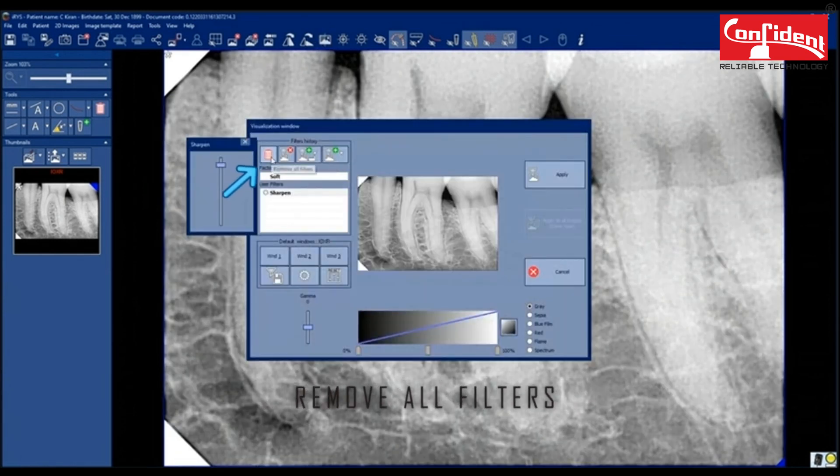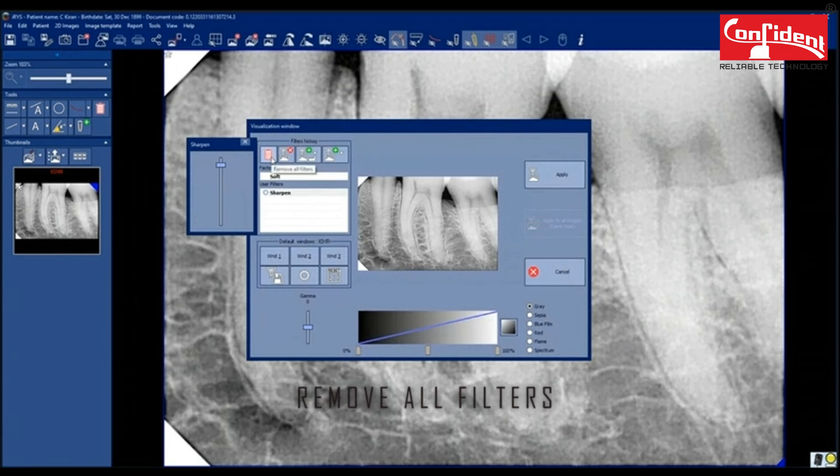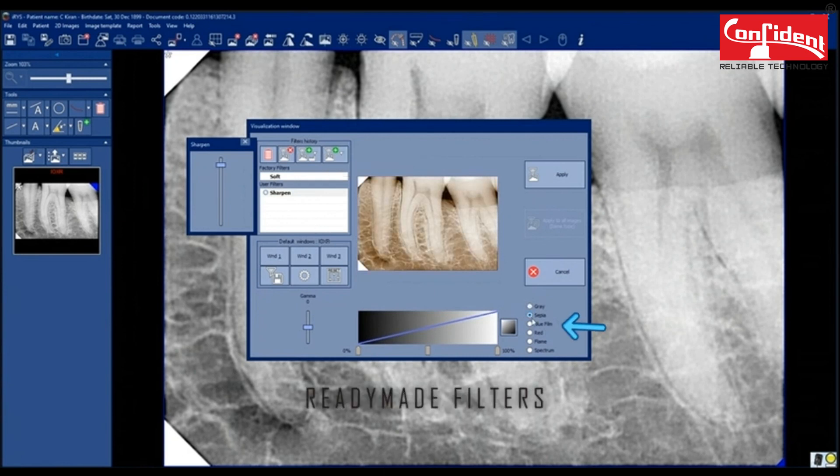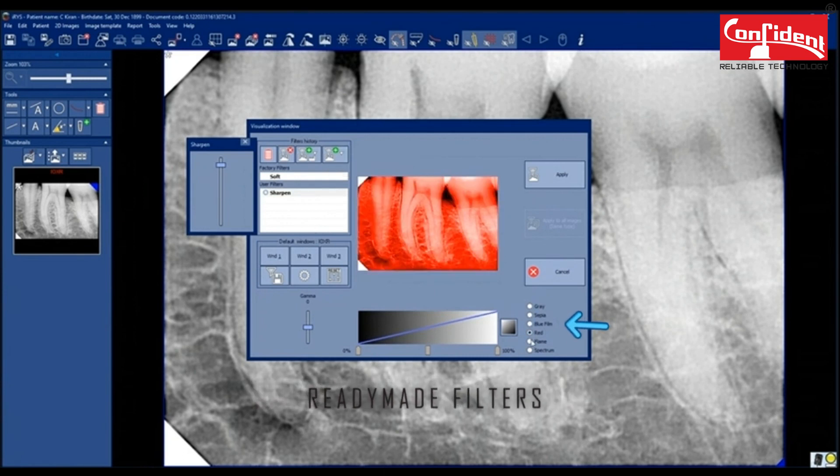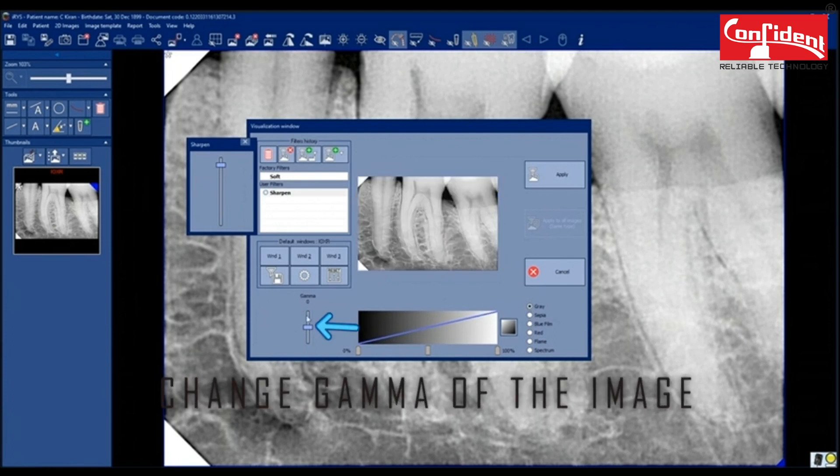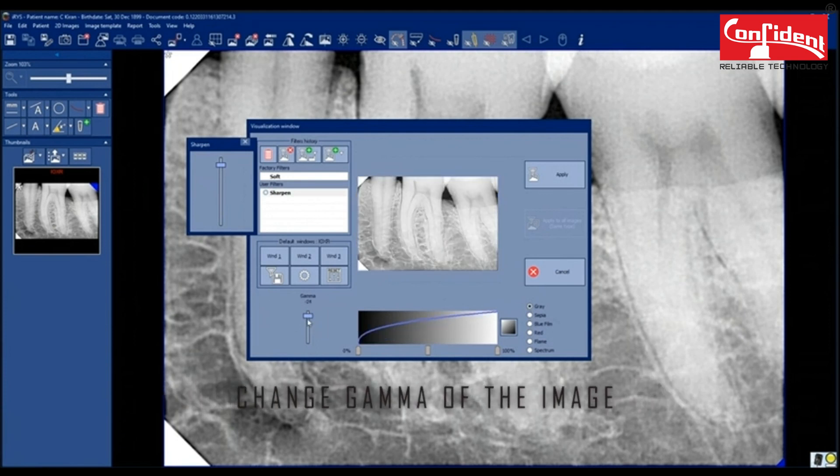Click here to remove all filters. Selected filter. Factory filter settings. Here you can choose from ready-made filters for the image. Change the gamma levels.